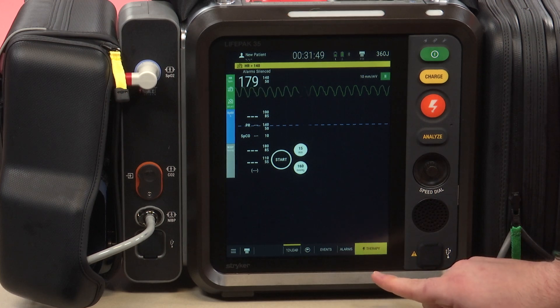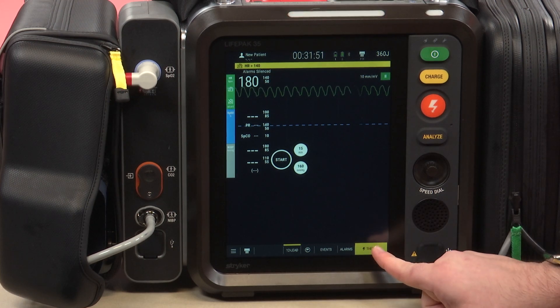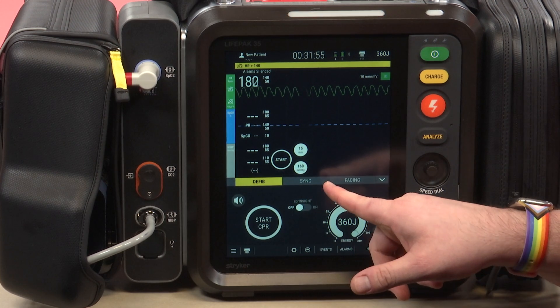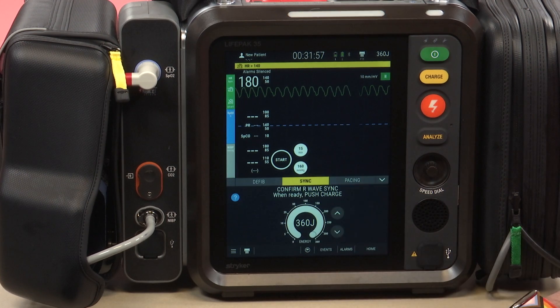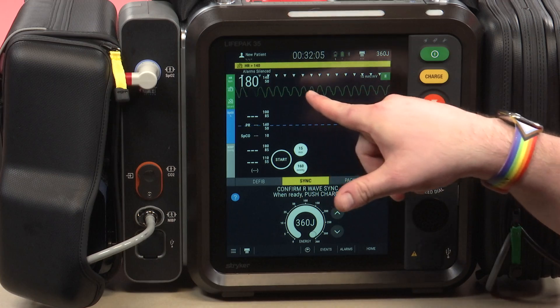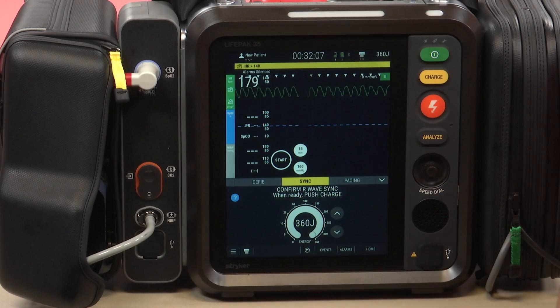The defib pads are on the patient and the four-lead is on the patient. We're going to go ahead and click the therapy button, then click the middle button called Sync, which is synchronized cardioversion. The first thing you will notice is it automatically syncs for us. You can see those little triangles at the top of the screen, which indicate the synchronization.